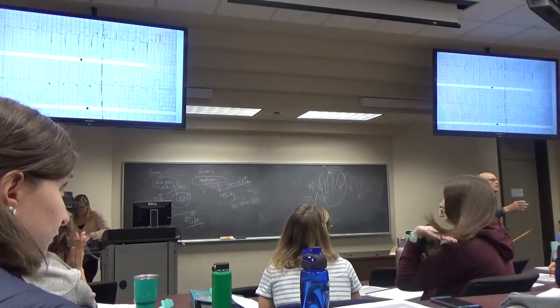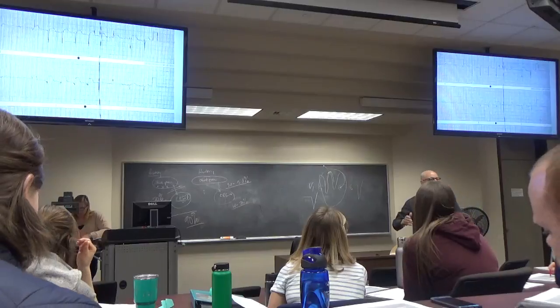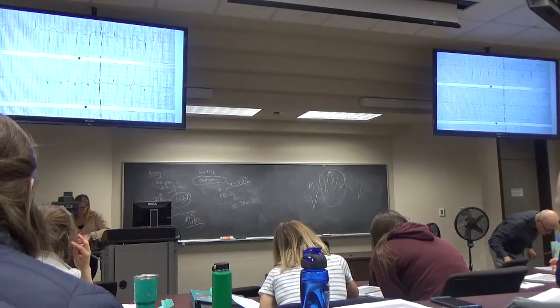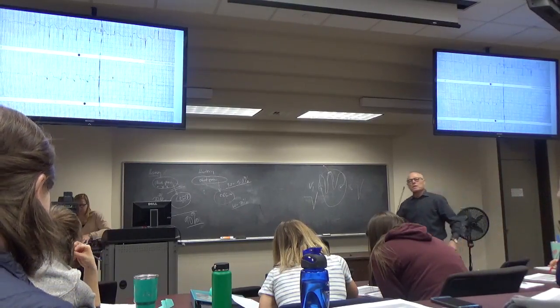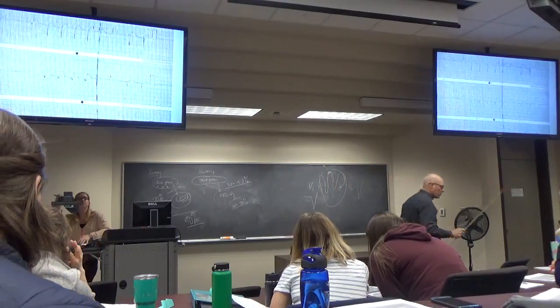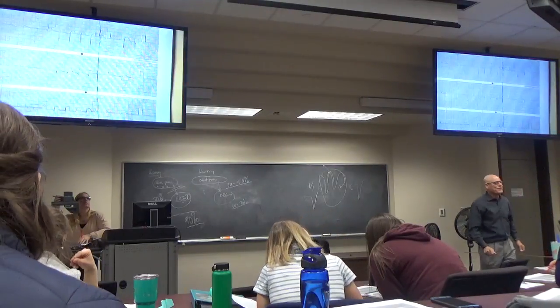Just apply a little bit of logic after what we've been talking about. Which one of those looks the most normal? The first. Probably the first one. Yeah, it's got a little more R and not much S. So, which one has the most abnormal repolarization curve? Second. Well, they all do.